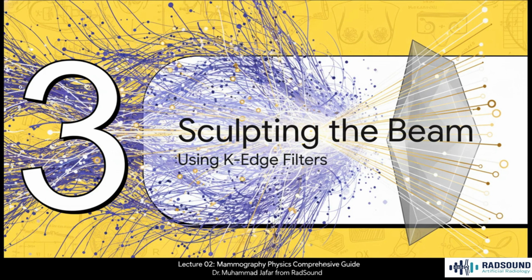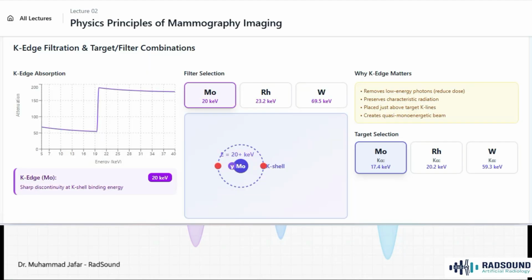But here's the catch. The raw beam from those targets is still too messy. It's full of photons that have energies that are either too high or too low to be useful. So the next critical step is to sculpt it, to literally carve away all the useless photons and leave only the perfect ones behind. So how do you sculpt a beam of X-rays?